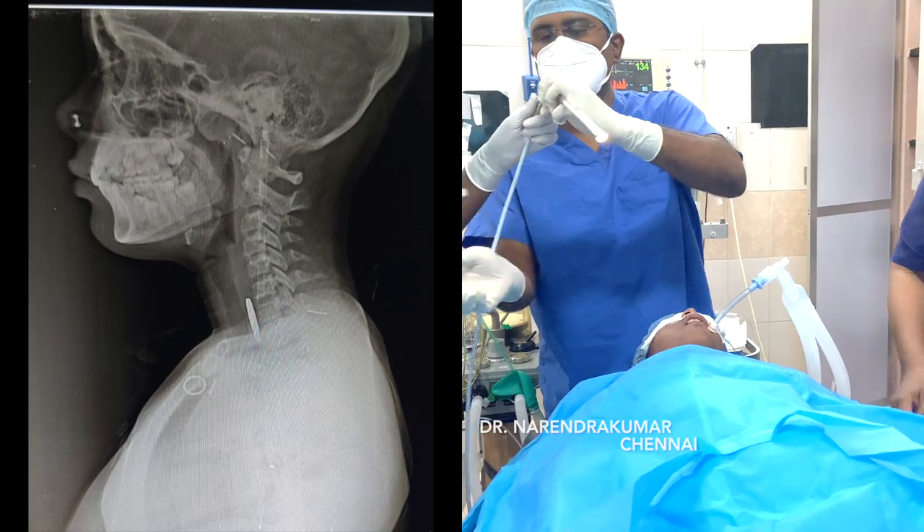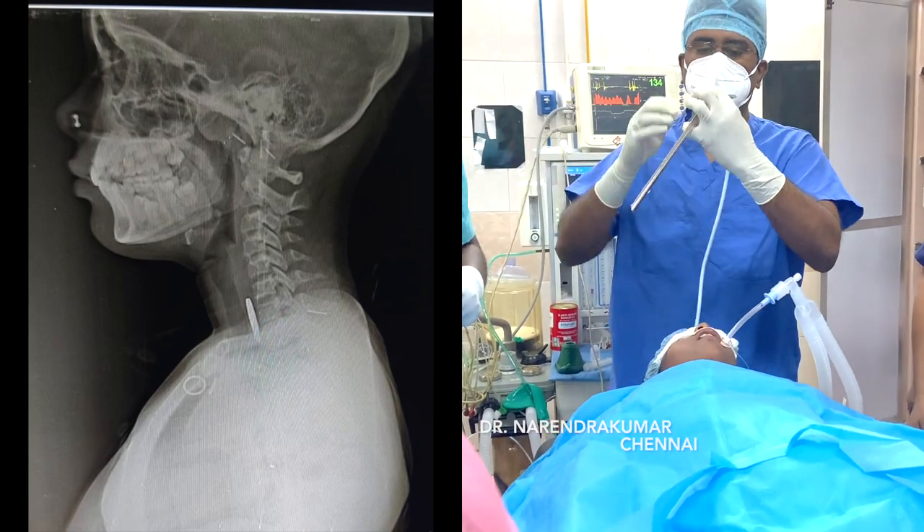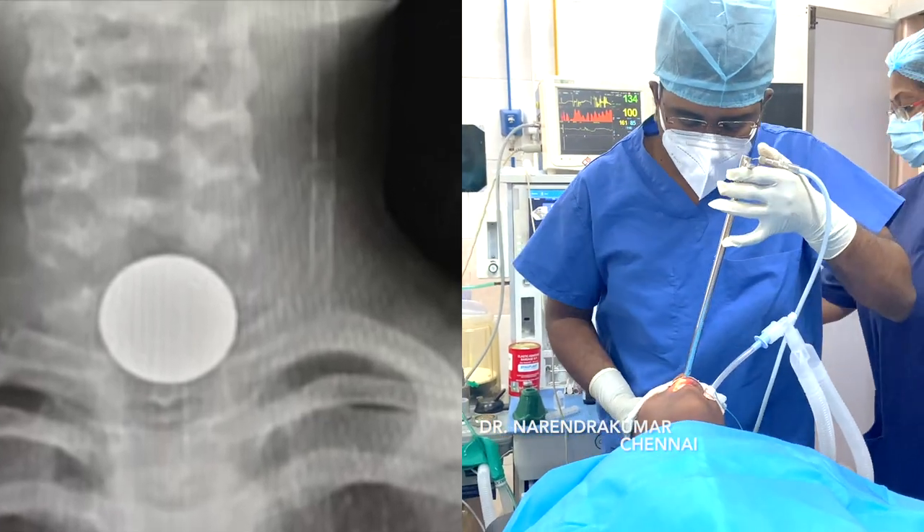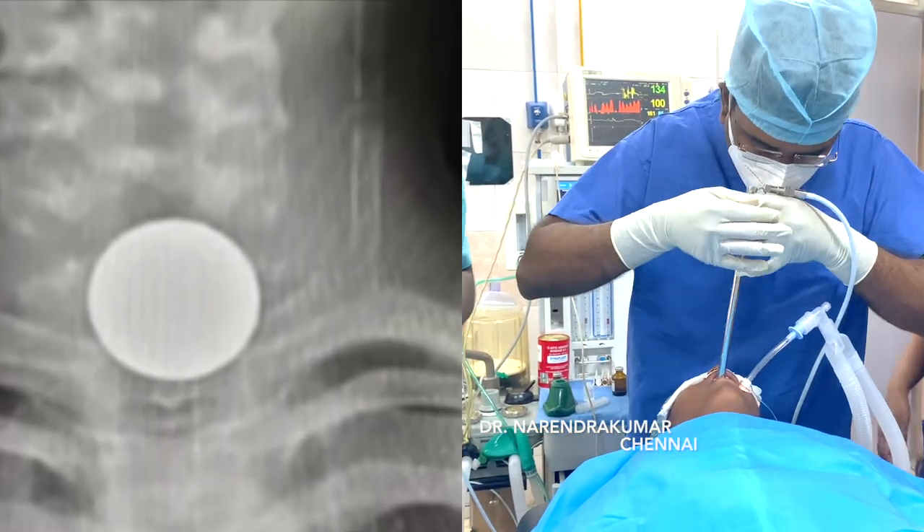You can see the location of the coin here. The first landmark is the patient under supine position with the neck slightly extended.